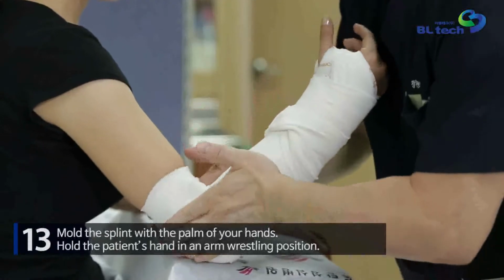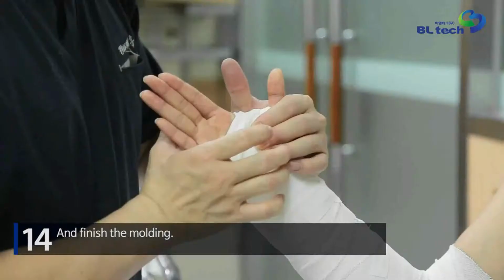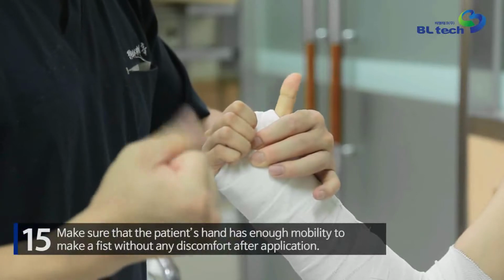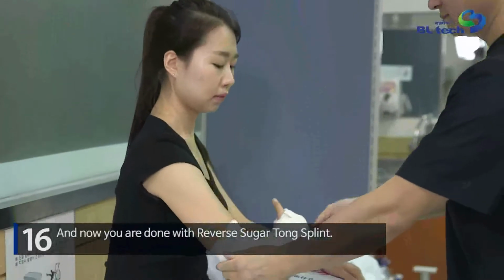Mold the splint with the palm of your hands. Hold the patient's hand in an arm wrestling position and finish the molding. Make sure that the patient's hand has enough mobility to make a fist without any discomfort after application. And now you are done with the Reverse Sugar Tong Splint.